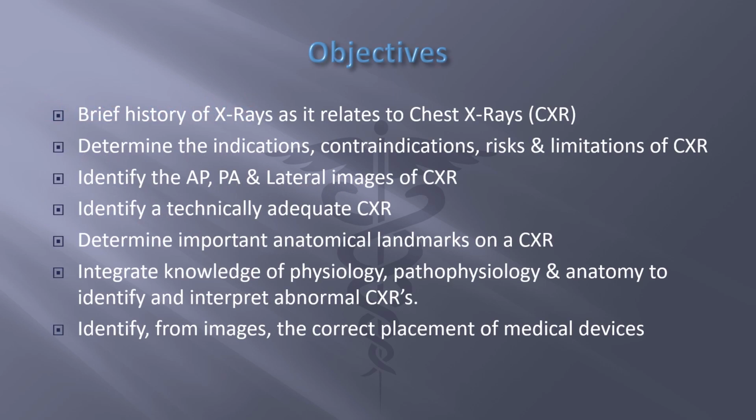With some objectives of this presentation, we'll briefly talk about the history of the chest x-ray, some indications, contraindications, some limitations of chest x-rays, and some different types of x-rays. Talking about chest x-rays, we do anterior-posterior, posterior-anterior, and lateral images.